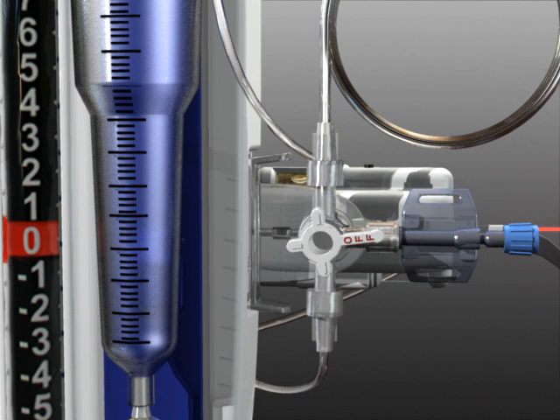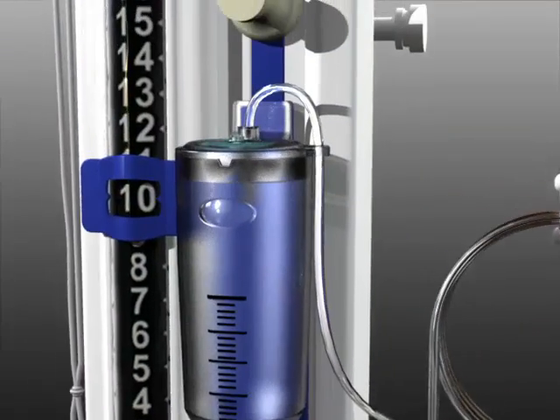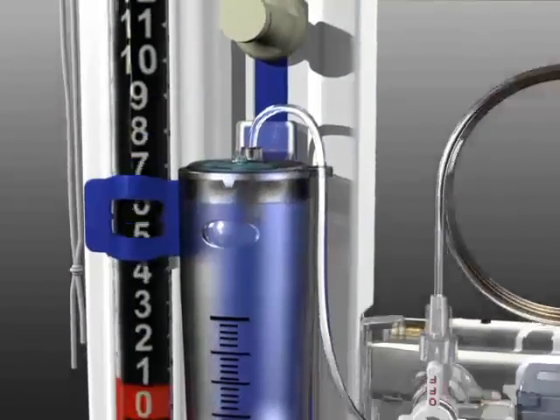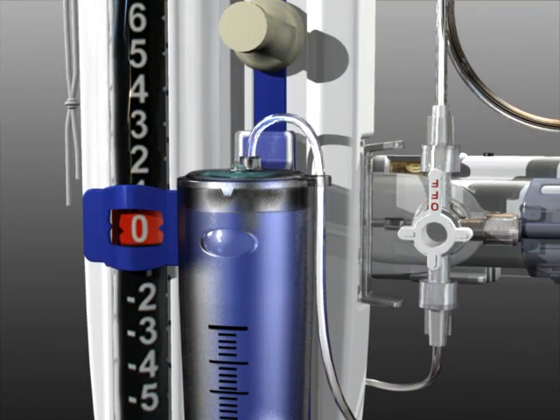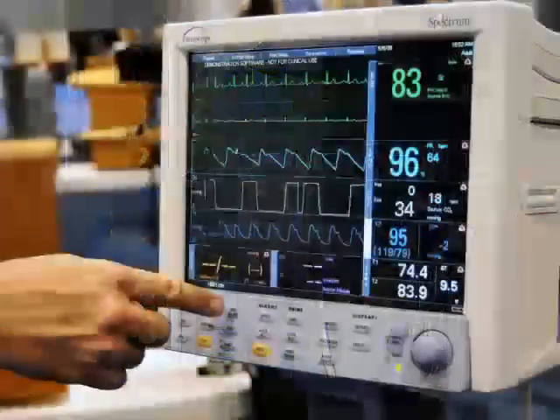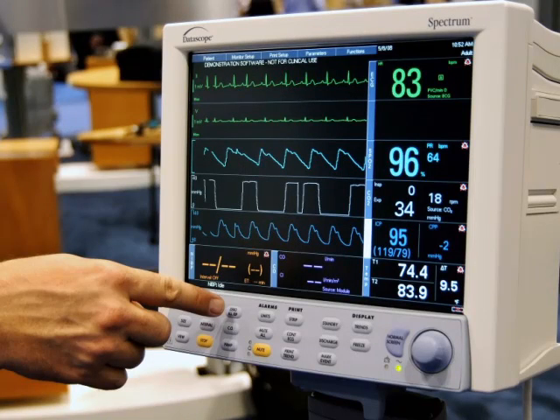Start by turning the main system stopcock off to the patient, but allowing communication between the transducer and the drip chamber. Lower the drip chamber until the pressure indicator window is centered at zero on the pressure scale. Press the zero button on the bedside monitor.